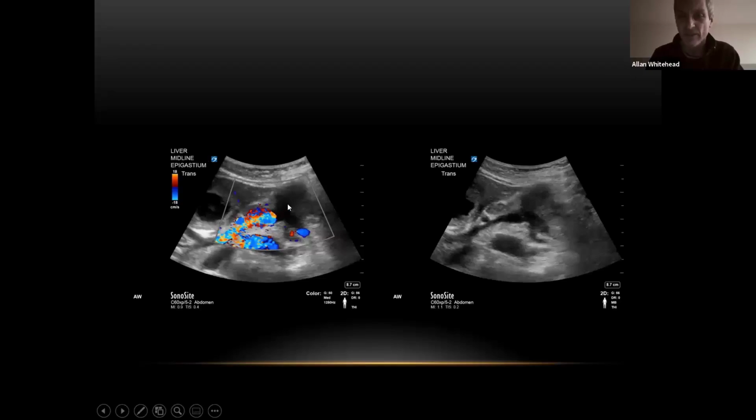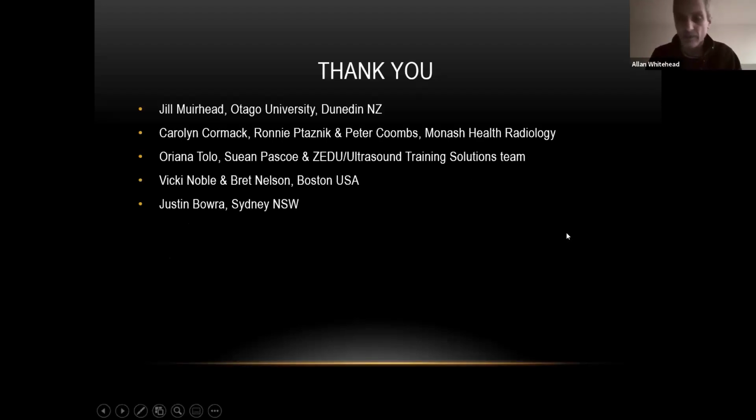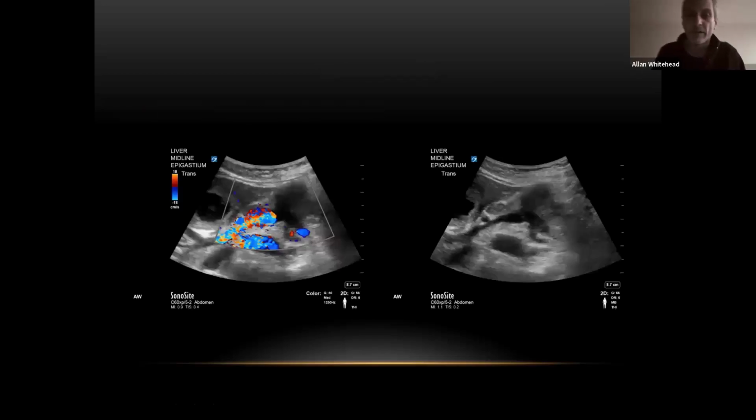Sort of getting that sense of the vessels coming right up into that tumor mass, as Suean was saying about having the portal splenic confluence in that area. Yeah, so that was a picture of that mass. It wasn't so hard to spot, it wasn't that subtle if you could feel it, and the GP thought there was a mass, and you got that liver metastases as well. So it was pretty easy to say something was going on. It definitely wasn't the aorta. Probably for that patient, it would have been better if it was the aorta, unfortunately.